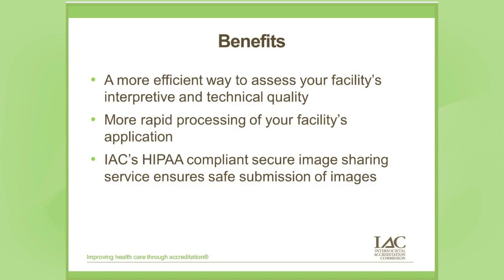Maria? So for nuclear, it's pretty much the same thing too. If you have a viewer, make sure that that is attached. Absolutely. We have found that with a lot of the nuclear images, if people just submit DICOM images, we can't see the processed data, we can't see anything. So make sure that you attach the viewer as well. Cindy, I just wanted to add one thing, that JPEGs are good for us in vascular as well.